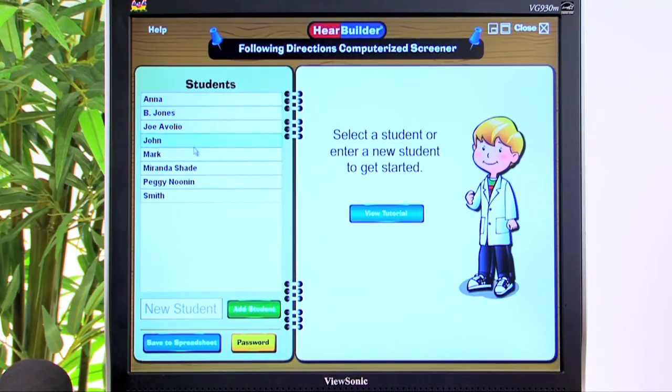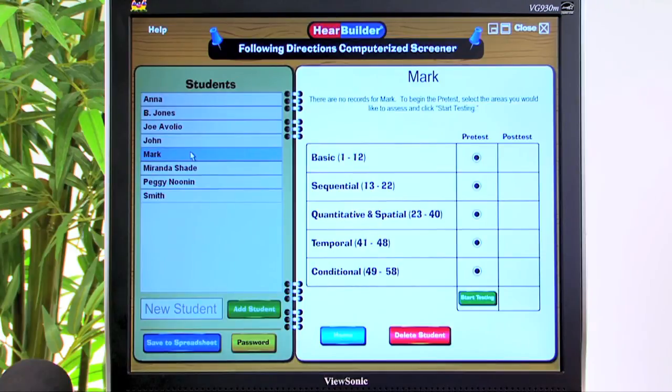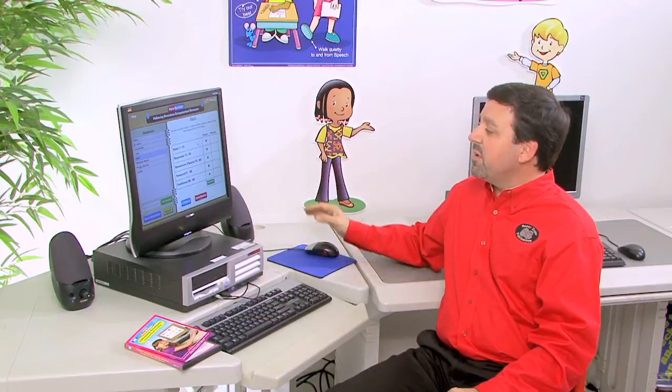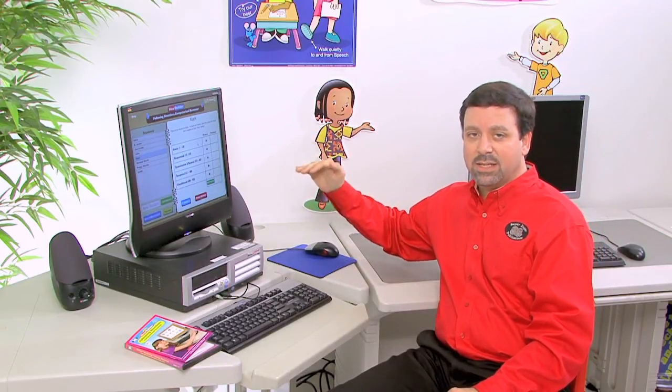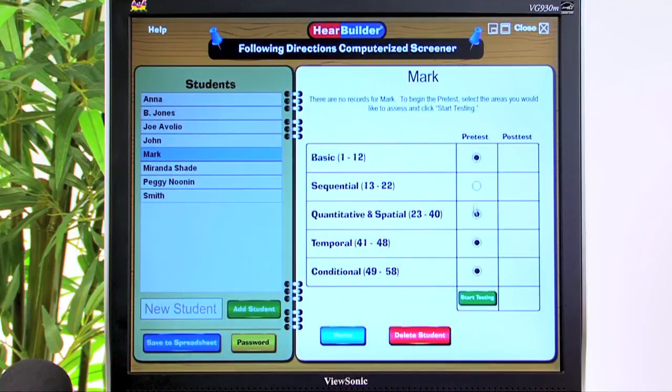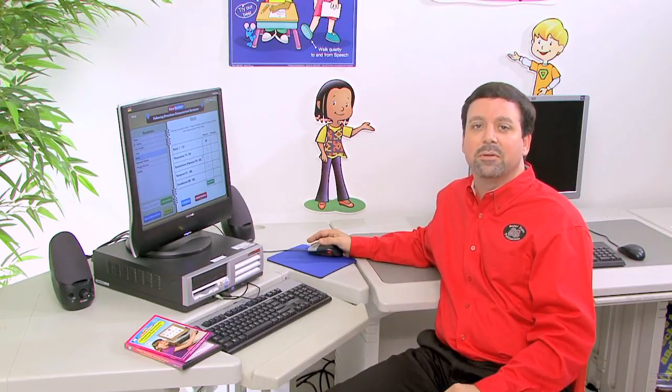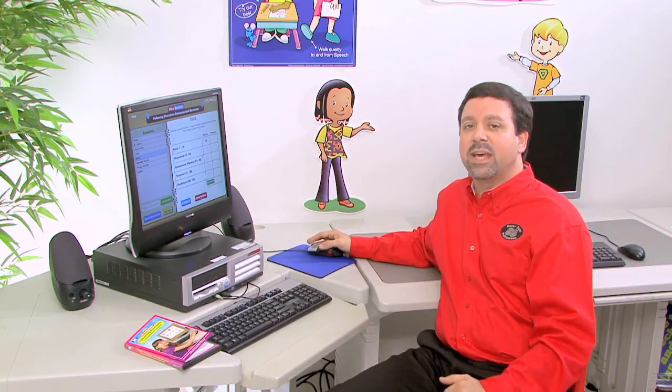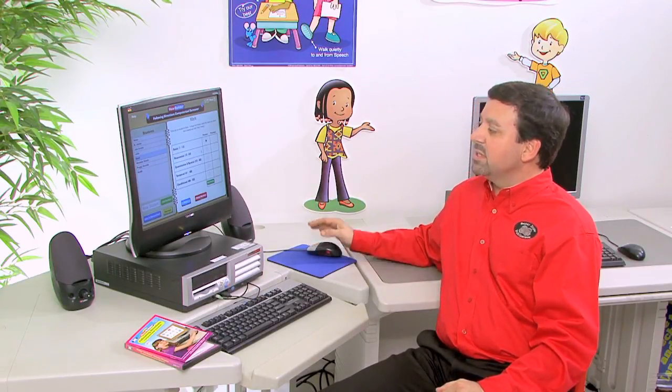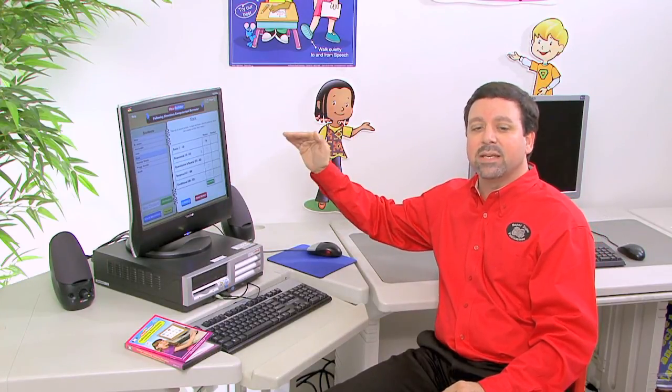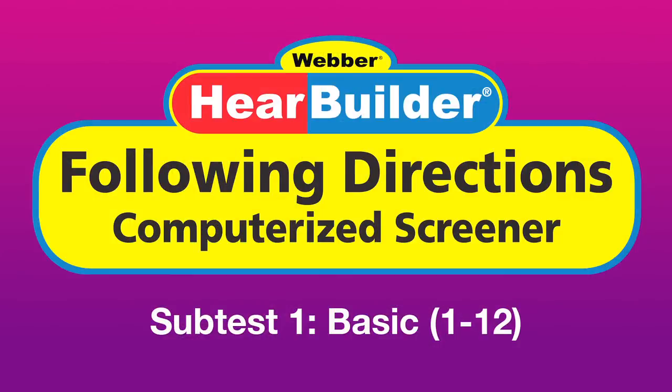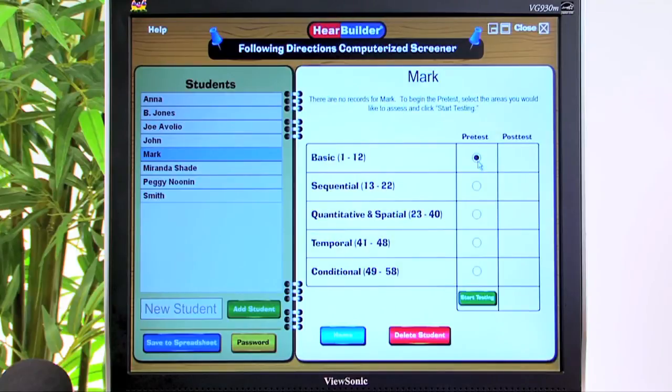So when we're ready to start the assessment, we can select a student's name on the left-hand side. Once we select our student that we're going to do the assessment and the screening with, this will default to have each subtest assessed. With this, we can also take away different subtests if we have a shortened time that we're going to do this screener, or if the student has difficulty focusing his attention to the task at hand. So for instance, let's take a look at some of the examples from the Basic Directions subtest.